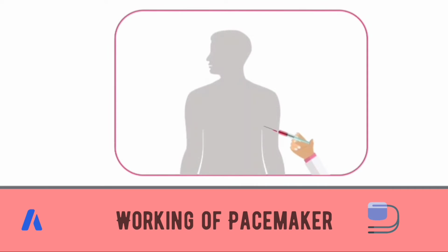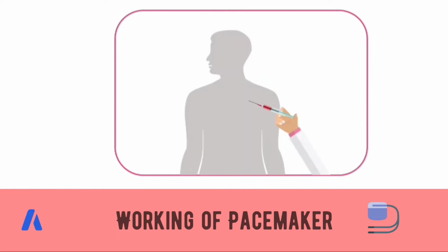A pacemaker generates a stimulating pulse that is large enough to cause depolarization without causing damage to the heart cells. Once the impulse is elicited from the pulse generator, the heart muscle depolarizes and enters a refractory period so that no cardiac cells can initiate another impulse for some duration of time.